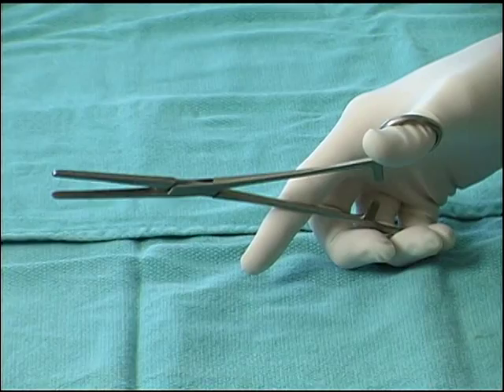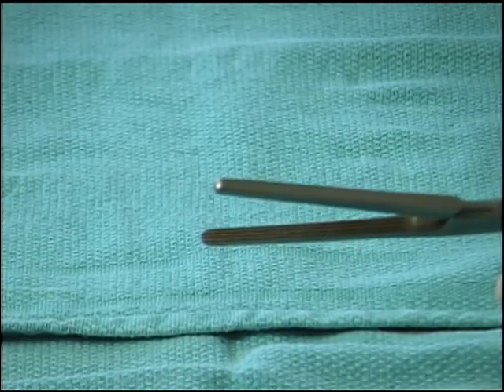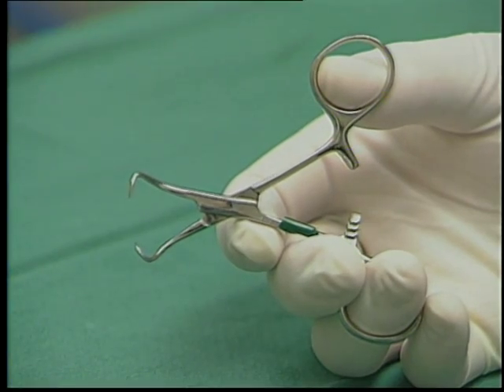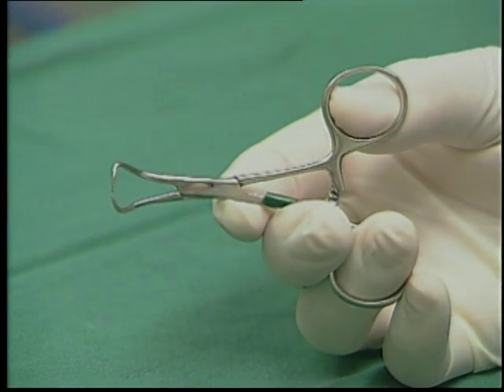Carmalt forceps have grooves that run parallel with the instrument. These grooves are designed to grip and crush. Towel forceps, as the name describes, have the purpose of grasping the towel or drape and securing it to the patient.